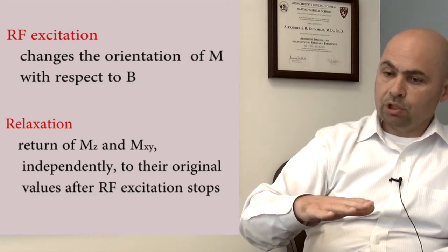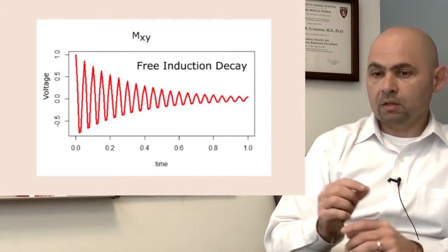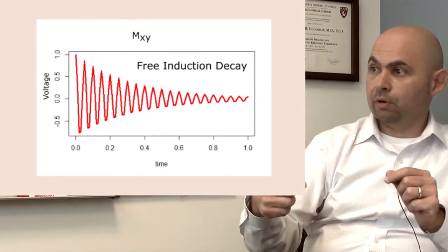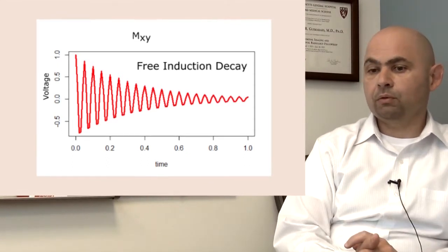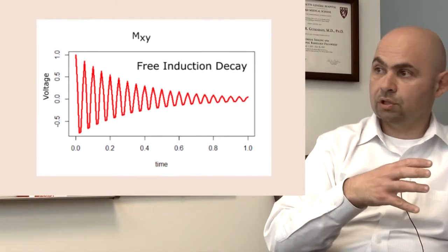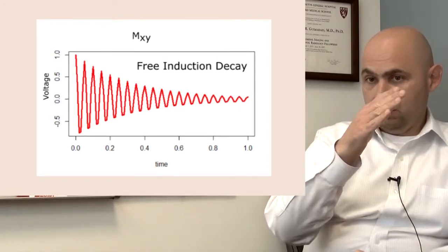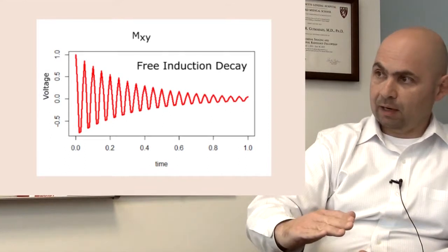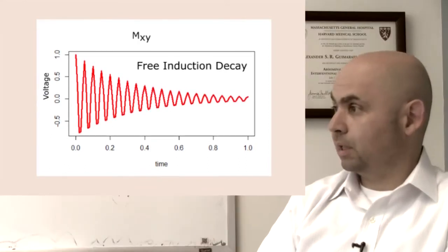As soon as that energy is transmitted and received, the water molecules will interact with themselves and lose energy to their neighbors. That is essentially a layman's view of what spin-spin relaxation is, because each spin will lose energy to its neighbor because it's moving in space. That is going to give you part of the dampening effect of your sinusoid, the free induction decay.